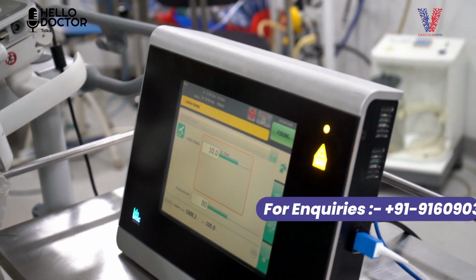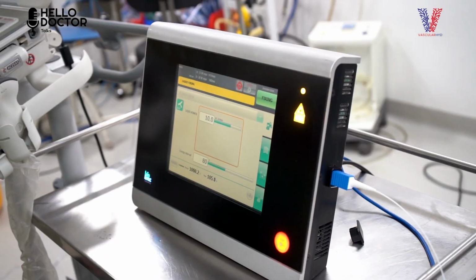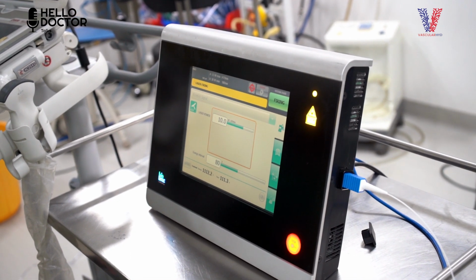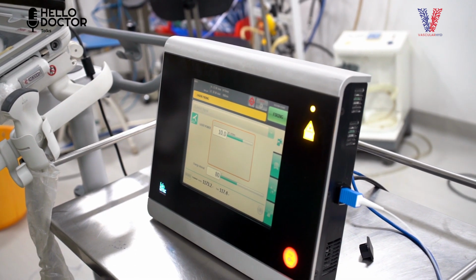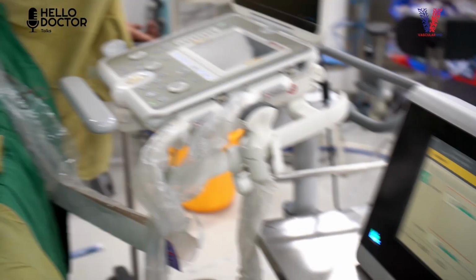And you can hear there is a beep from the machine after every 80 joules is given. Like that was a beep. Let's hear the next beep. Right, so that beep tells us that 80 joules has been given. Between each beep there is 80 joules, and we start pulling the fiber.